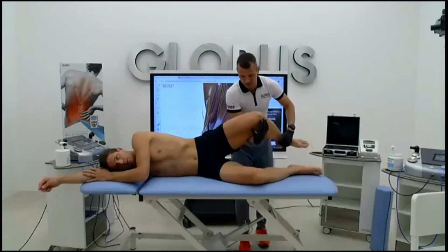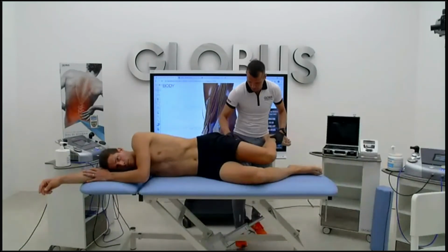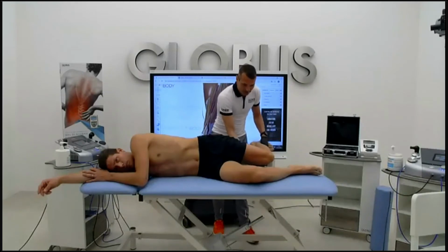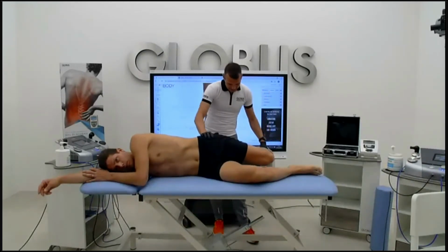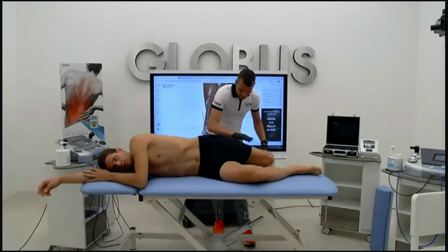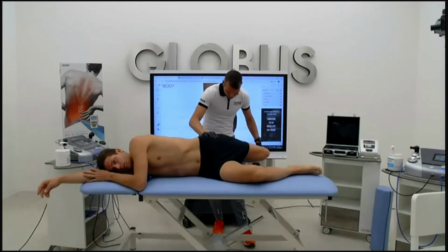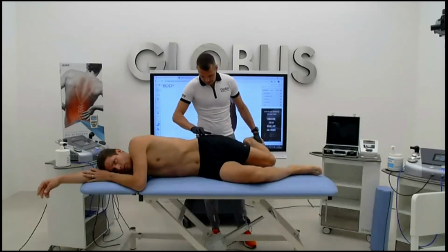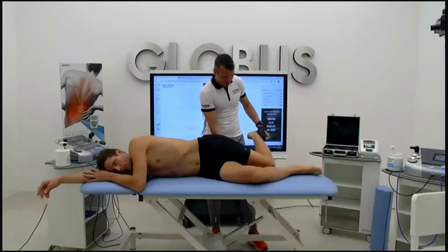Okay, yes, in this case we have it actually. We cannot reach the bed. It's going down, but not so much. The extension is good. So maybe we need to treat the tensor fascia lata here, the gluteus minimus, as I told you just before.